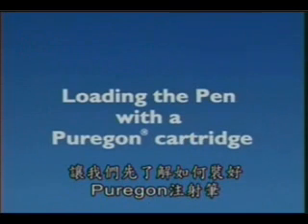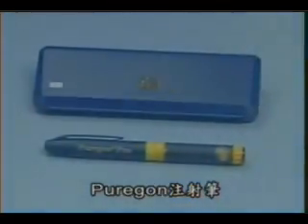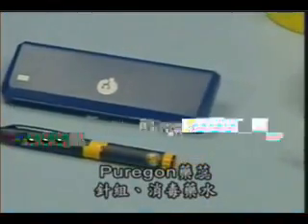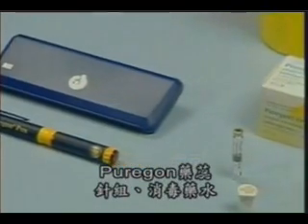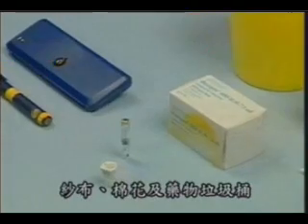For the actual injection, we will run through the steps of how to charge the Puregon pen. This is what you will need for the injection: a Puregon pen, a Puregon cartridge, a needle, some disinfectant, gauze or swabs, and a sharps disposable bin.